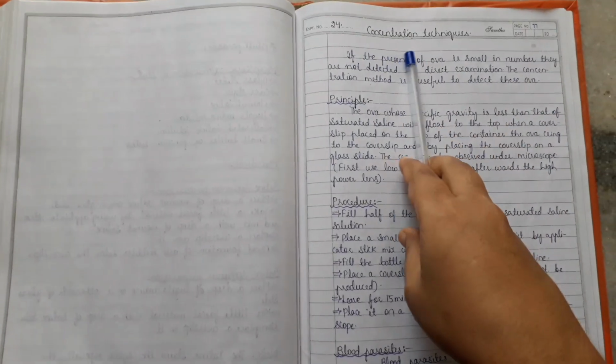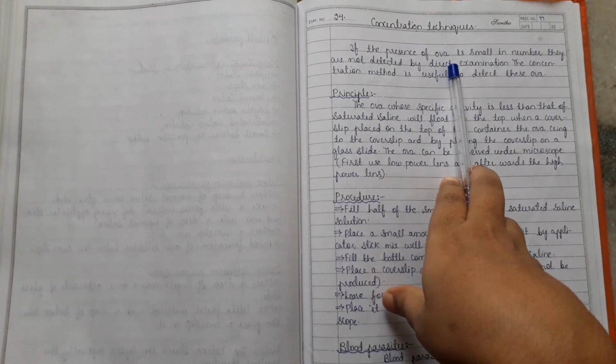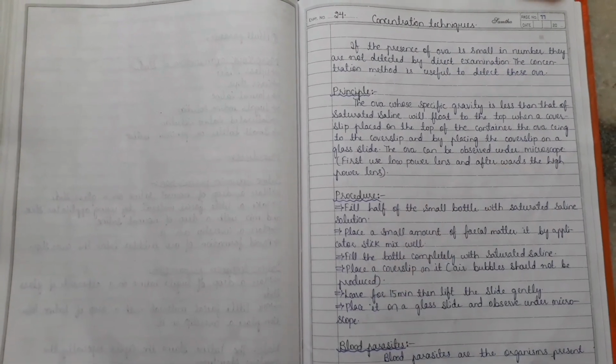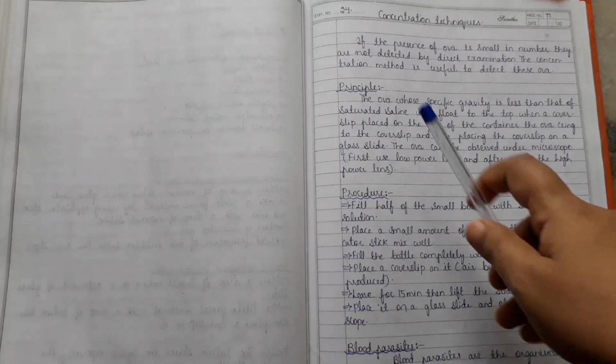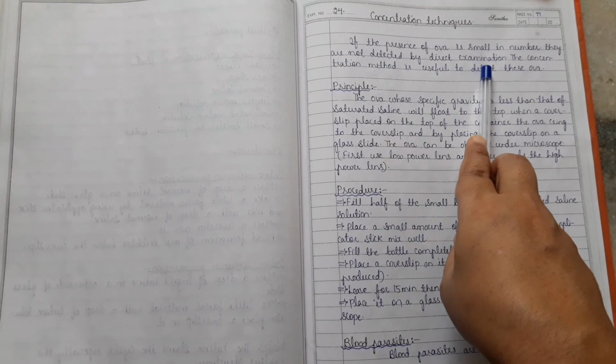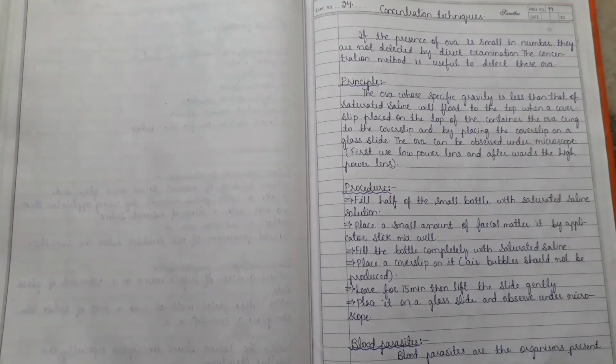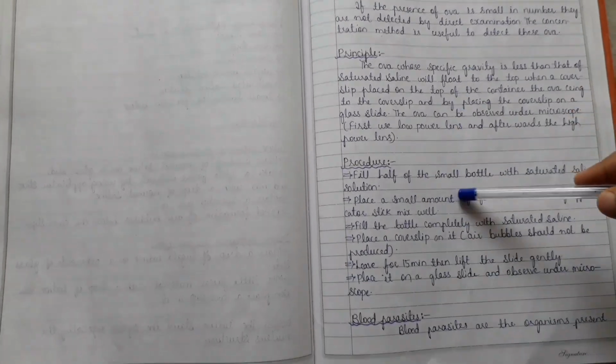So the concentration techniques: if the ova are small in number, they are not detected by direct examination. So the concentration method is useful to detect these ova. This is the principle, this is the procedure.